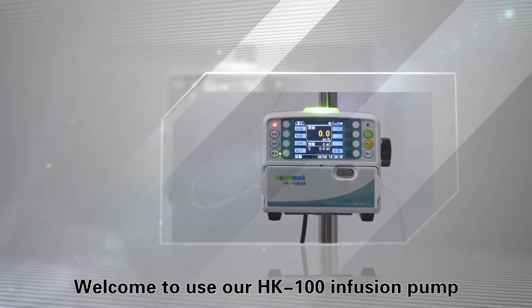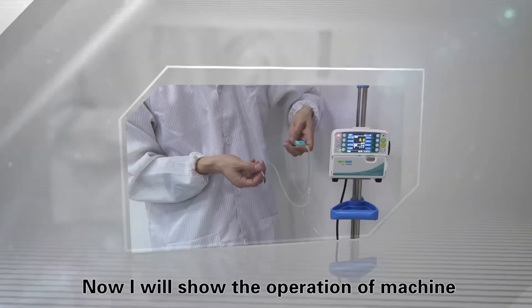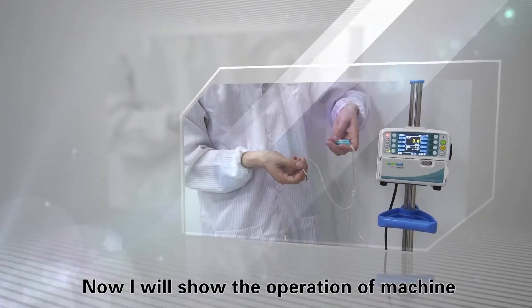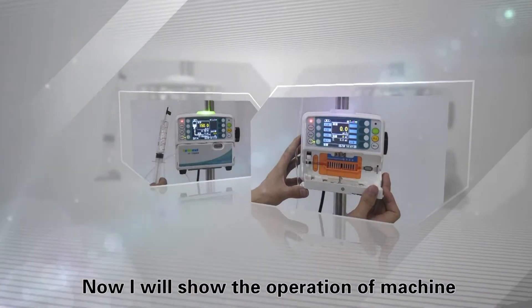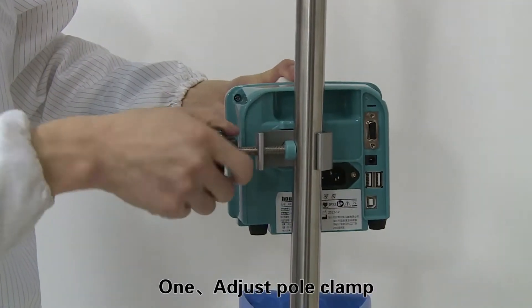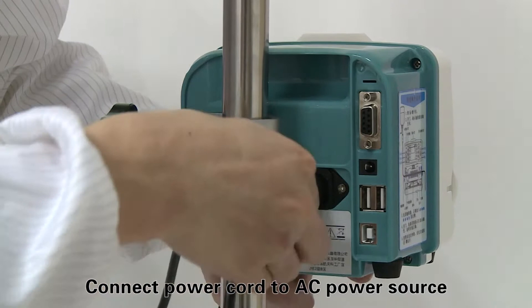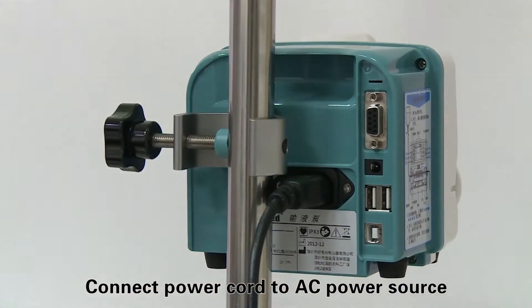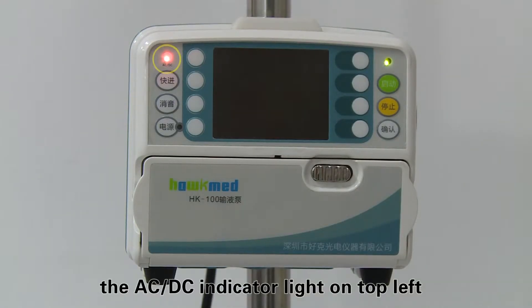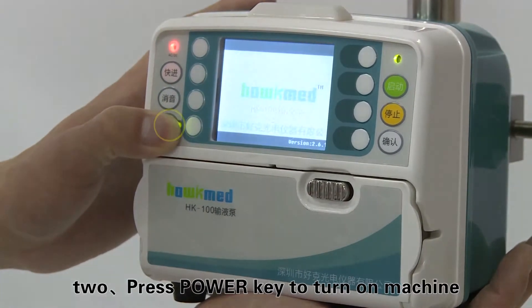Welcome to use our HK-100 infusion pump. I will now show the operation of the machine. Step one: adjust the pole clamp to fix the machine on the IV pole, then connect the power cord to the AC power source. The AC/DC indicator light on the top left of the machine will turn on. Step two: press the power key to turn on the machine.